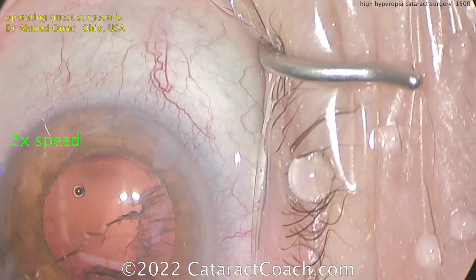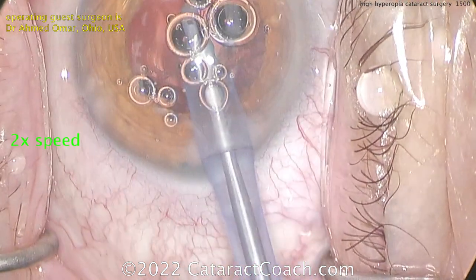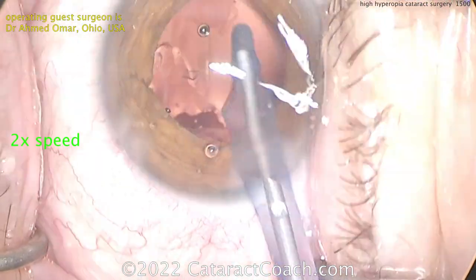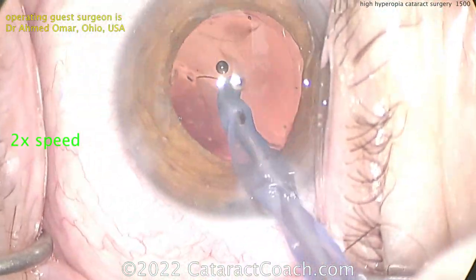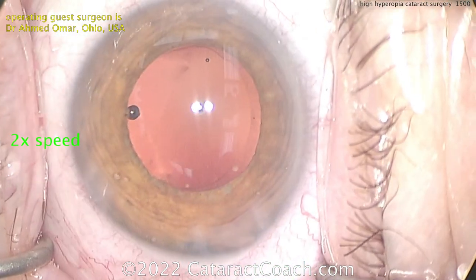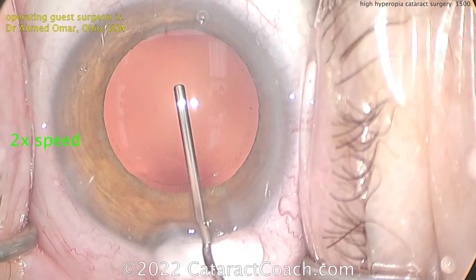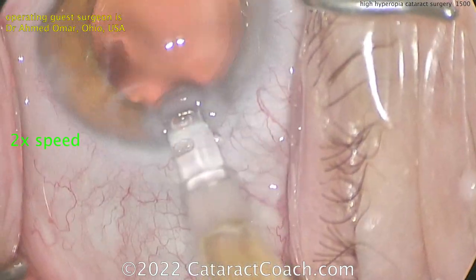We have sped up the video to about twice normal speed to show you the whole case. You see the two extremes — yesterday's video showed a high myope with a 30mm eye. Here, video number 1500, we're showing you a tiny eye with a 20mm axial length. As a surgeon, you have to be prepared to do all of the above and everything in between. By the way, congratulations on 1500 videos — a new video every day for 1500 days in a row, never missed a day.